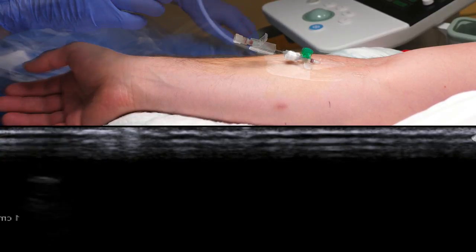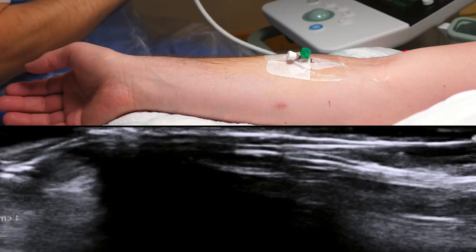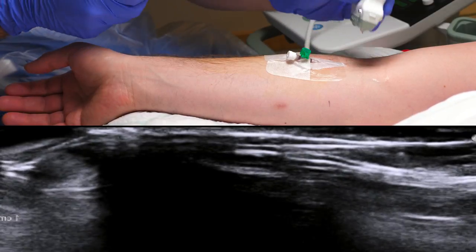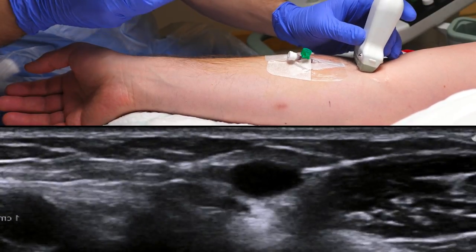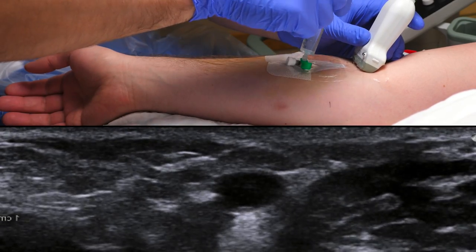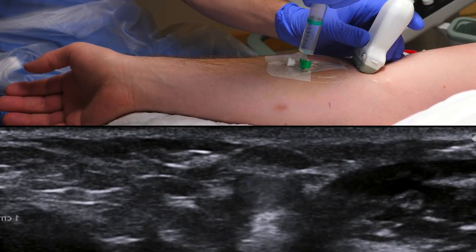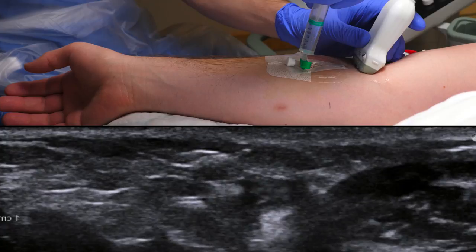Secure the catheter in the usual manner, and then verify the intravascular location using the following technique. Place the probe just proximal to the tip of the catheter, tilt the probe slightly in the distal direction, and inject a small amount of saline. Minute amounts of air will act as a contrast, and you can see how the vein bulges on injection.